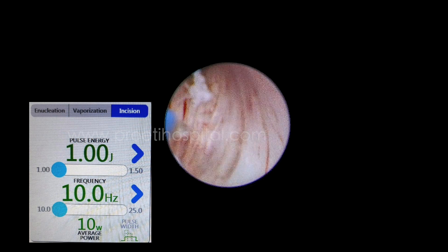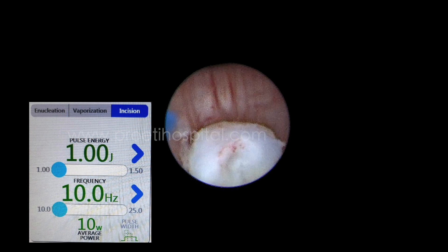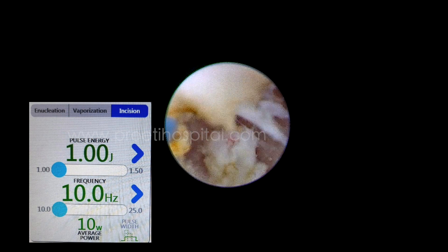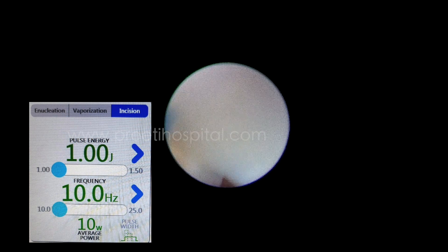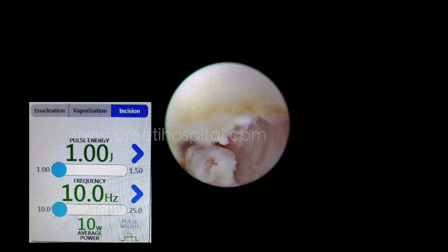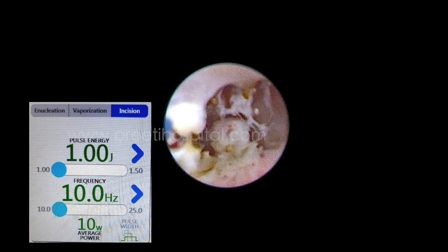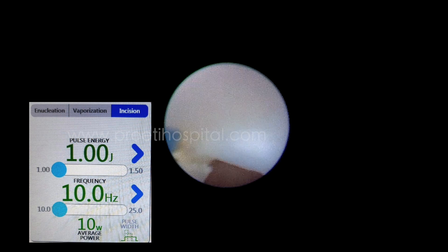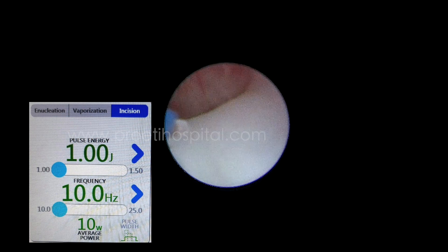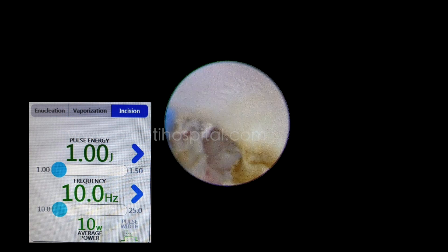As I come in and out, this is a dilated urethra — coming out, and whenever the dilatation stops beyond the veru, that is the valve. This valve will be predominantly a thick valve present anterolateral, not posteromedial. The posteromedial part is not important; the anterior part is more important. When the scope gets pushed out, that is the sphincter. Every time you have to cross the sphincter, go inside, see the veru, come out, and then go anterior.